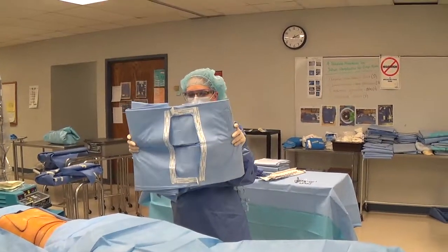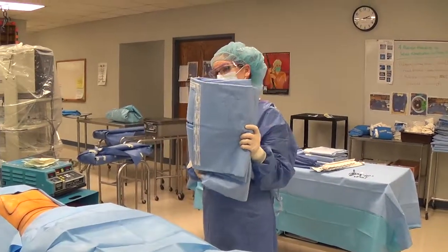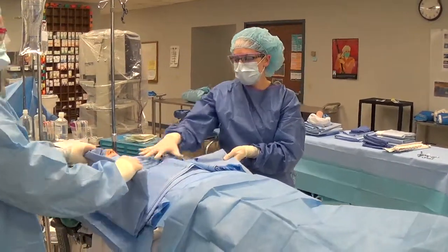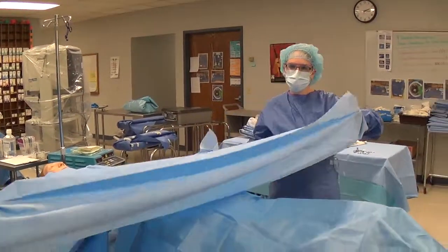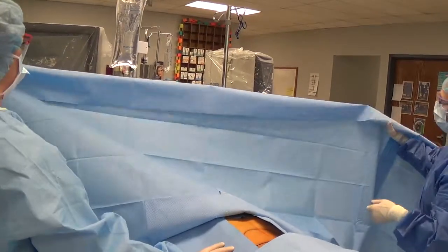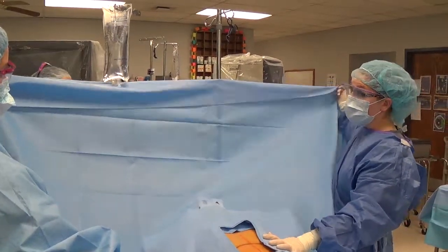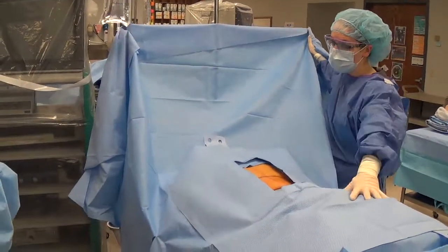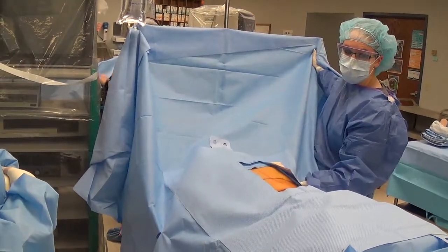Then place the laparotomy sheet. It has a rectangular shaped fenestration — look for the picture of the person and orient the head toward the head and foot toward the foot. Ask your surgeon whether they want stickies on or off, or check your preference card. Position the fenestration over the squared-off area; if the adhesive is exposed, stick it down now. Open up the drape going to the foot first — grab the top layer, cup your hand to the inside so it doesn't get contaminated, and extend out over the foot. On the head side, open any armboard covers, cup your hand to the inside toward anesthesia, then bring the other hand to hold the fenestration to prevent drape shifting. Wait for anesthesia to attach it to the IV poles so it doesn't fall below sterile level. If the fenestration is off, you cannot shift the drape — you would need to cut the fenestration to expose the correct incision site.